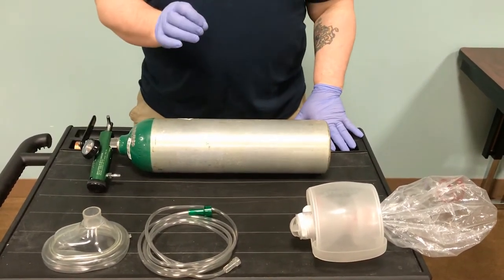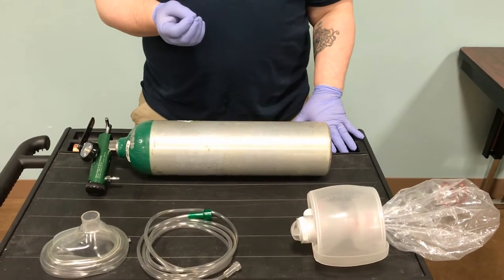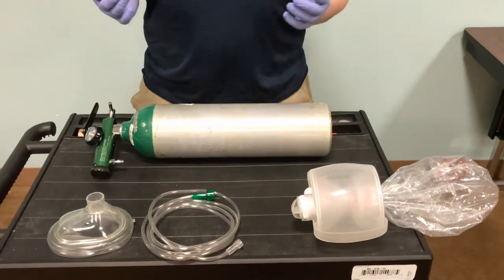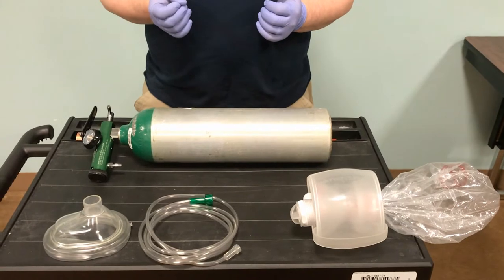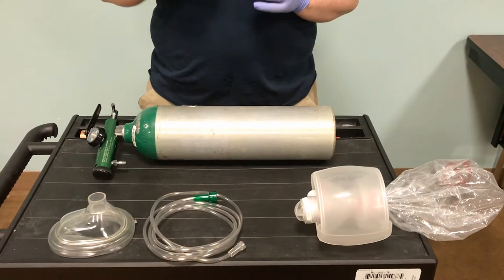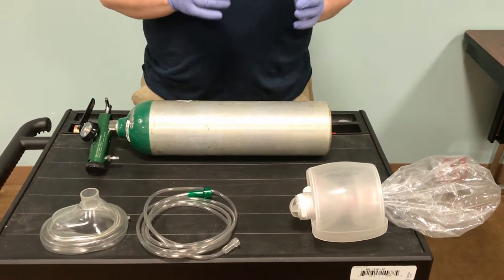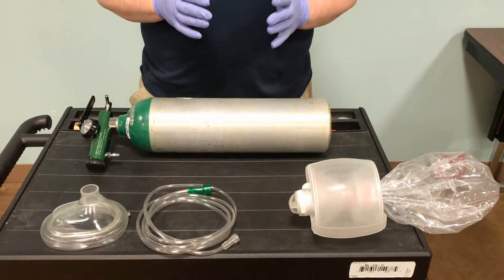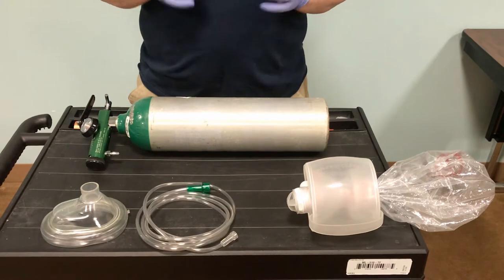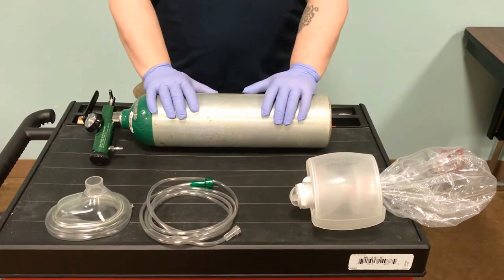When we look at using our BVM, bag valve mask, this is where we're taking over ventilation of the patient. Remember that ventilation is movement of air. When we look at breathing, the big question is: is it adequate — adequate to sustain life? If somebody is breathing way too fast, they're tachypneic, or they're hypoventilating — breathing four, six, eight times a minute — it's inadequate. They're not going to get the gas exchange they need.